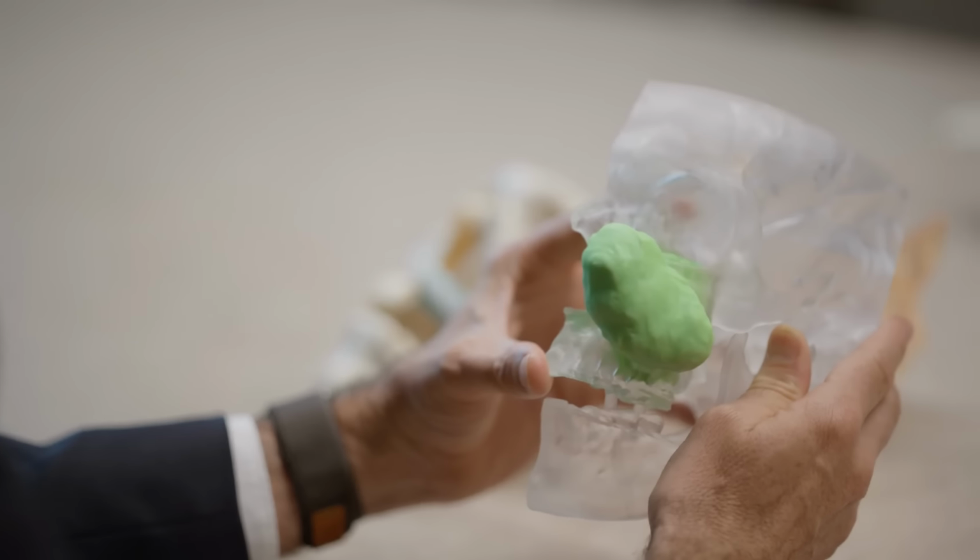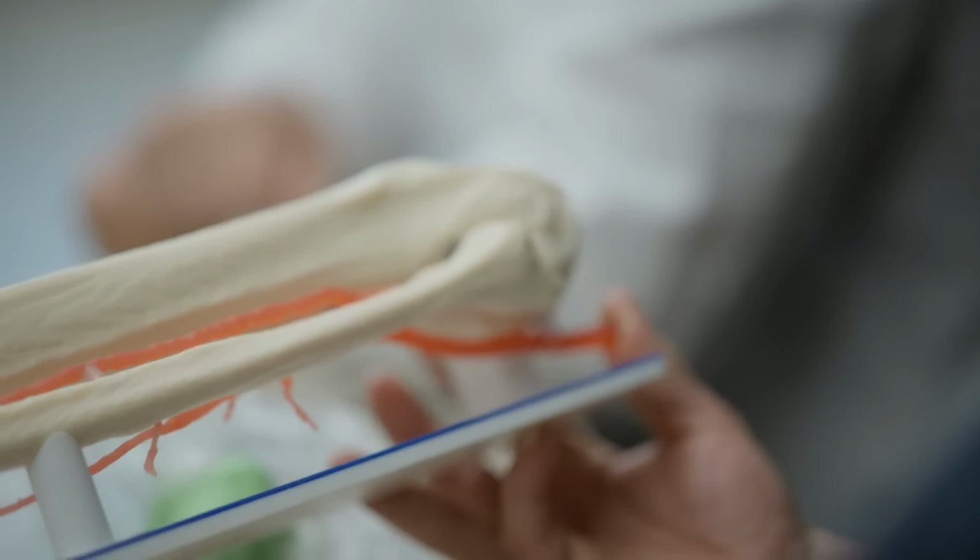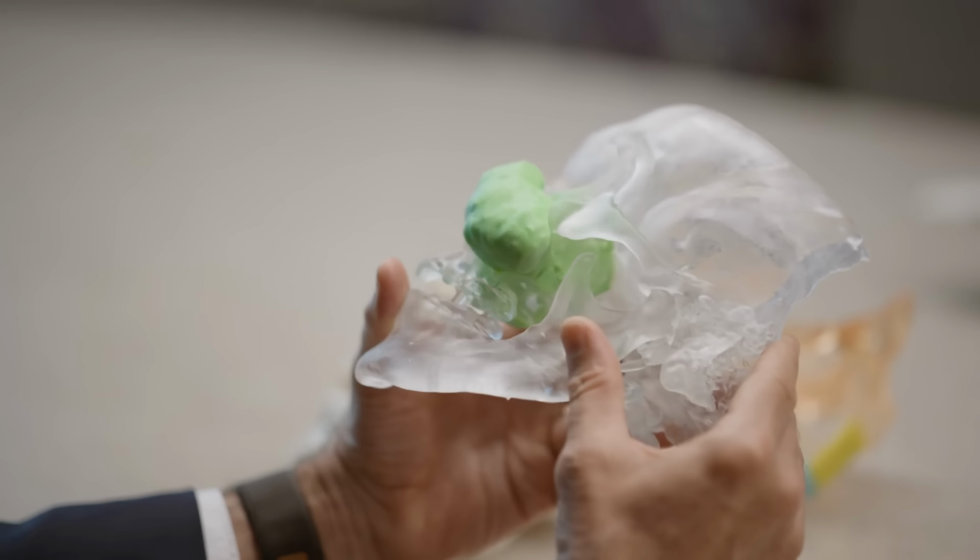These are really long operations. We used to have to take out the tumor, clear our margins, envision the defect, measure the hole, harvest the fibula, take that up, cut it, see if it fit. With this precise modeling, one of us will be taking out the tumor, the other will be taking out the fibula, actually cutting that in place while the leg's still hooked up, these blood vessels are still hooked up, so that as soon as the tumor's out, this is ready to go. Then that patient can spend several hours less on the operating table and get a lot less IV fluid, and that translates into a lot quicker recovery.